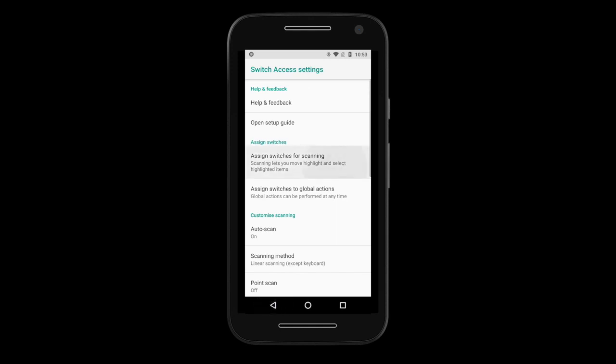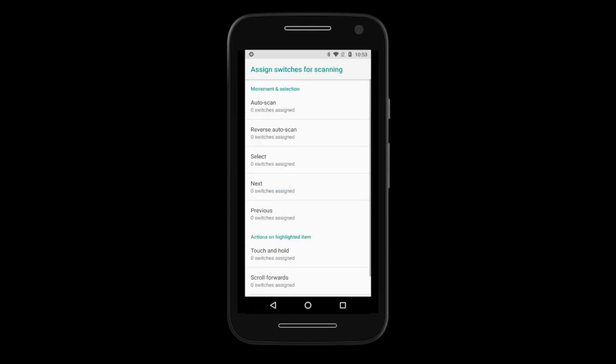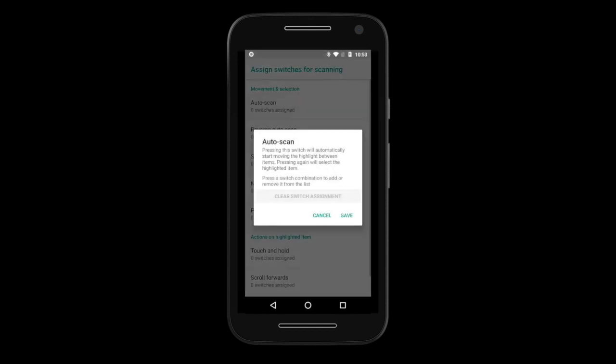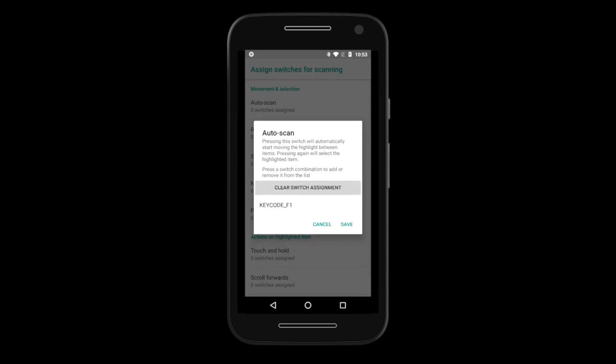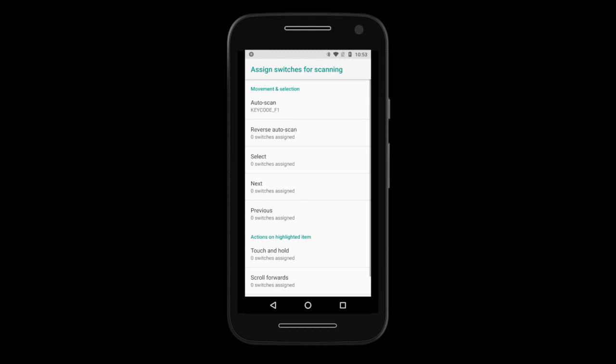Once Autoscan is enabled, we can assign a switch. Go to Assign Switches for scanning and select Autoscan. In the next screen, press your switch connected to Tecla E. Once it has been registered, tap on Save. Once you have assigned your switch, we suggest you personalize it with the following options.